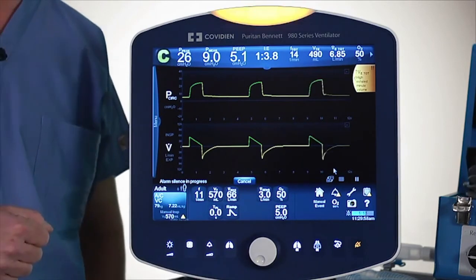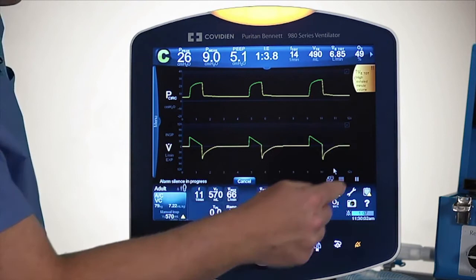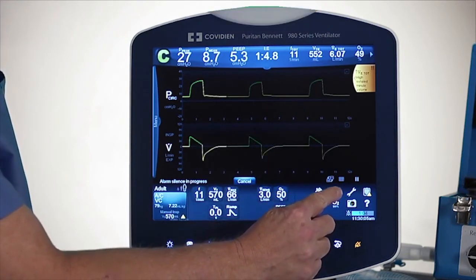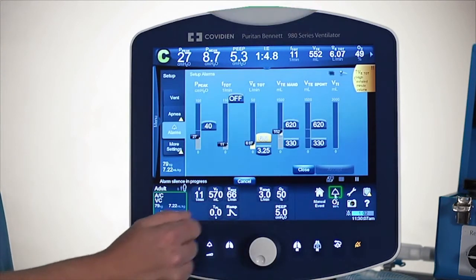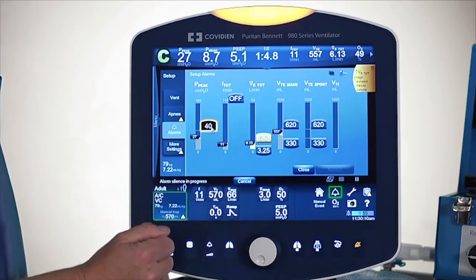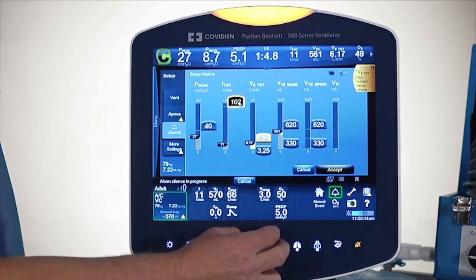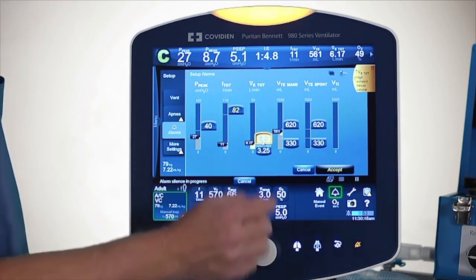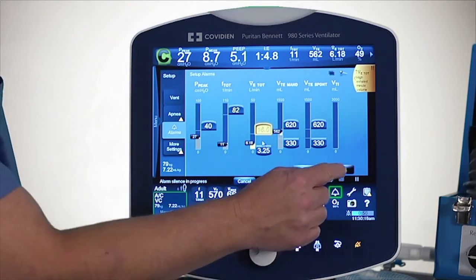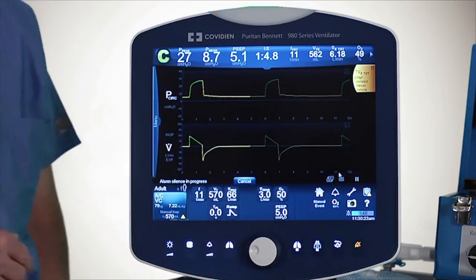Now, what I'm going to do is address this alarm that we have up on the top right hand side. I'm going to pull up my alarm screen with the little alarm icon. What you're seeing is the settings are displayed for each individual parameter. Right now I have one that's in yellow, so I'm going to go ahead and raise this one up for now — we'll talk more about the alarms in just a minute. And that will get rid of the alarm.